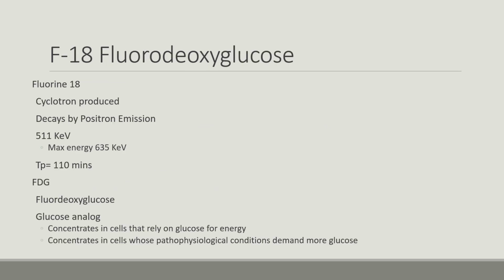Just to review the radiopharmaceutical, it is F18 fluorodeoxyglucose. That is fluorine 18, which is cyclotron produced, decays by positron emission. Has 511 keV with a max energy of 635 keV. The physical half-life is 109 to 110 minutes.